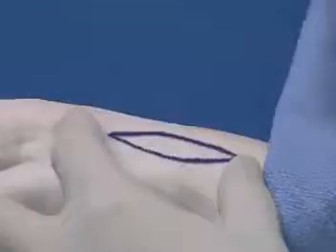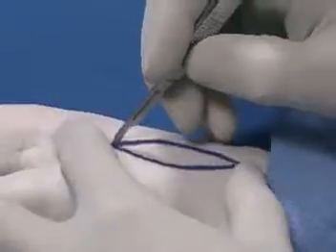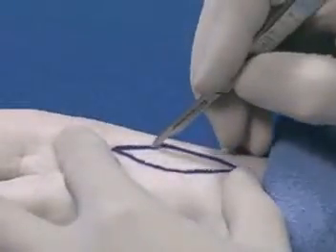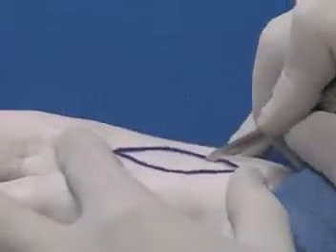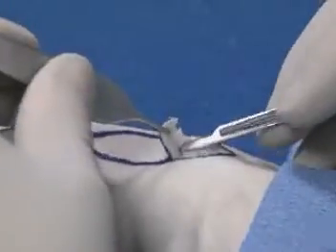The fusiform excision is marked with a length of 1.5 to 3 times the width. The intervening skin and soft tissue is then excised. The incision made in the skin edge should be perpendicular to that skin edge. The fusiform to be excised can then be removed with sharp dissection using either knife or scissor.